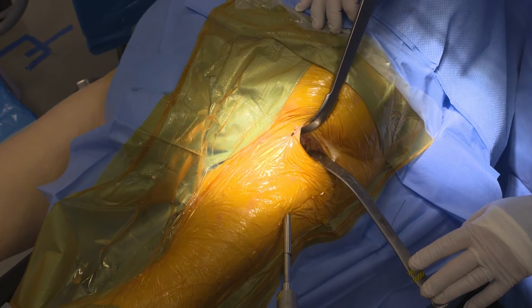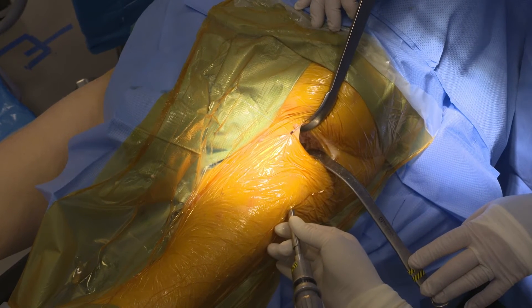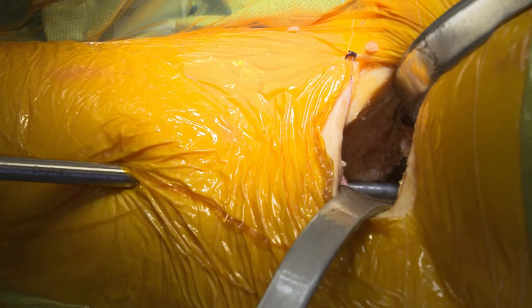Every time a reamer goes in and out of the acetabulum with a standard approach and standard instrumentation, the position of that reamer changes every time. With the cannula and the path technique, that reamer is going to end up in the exact same location and exact same trajectory, so I've found I don't actually have to look at it under fluoro. On top of that, because the instruments aren't in the way and the drive shaft of the reamer is not blocking your view, you can actually watch it under direct visualization through a pretty small incision.